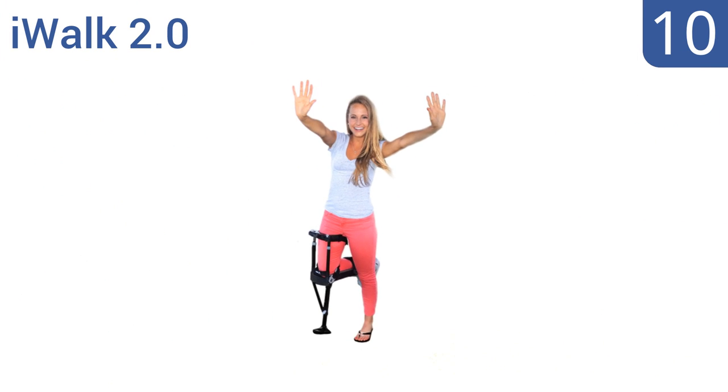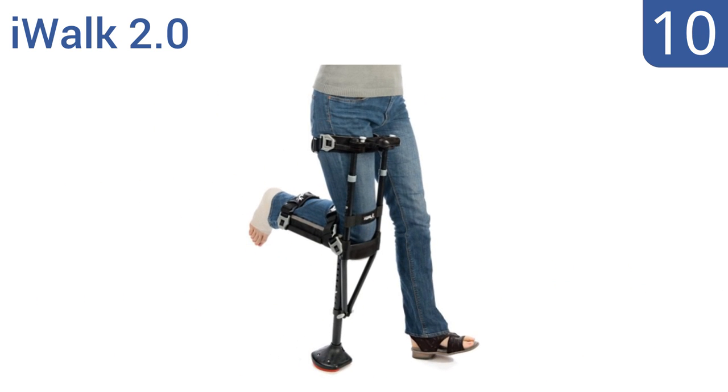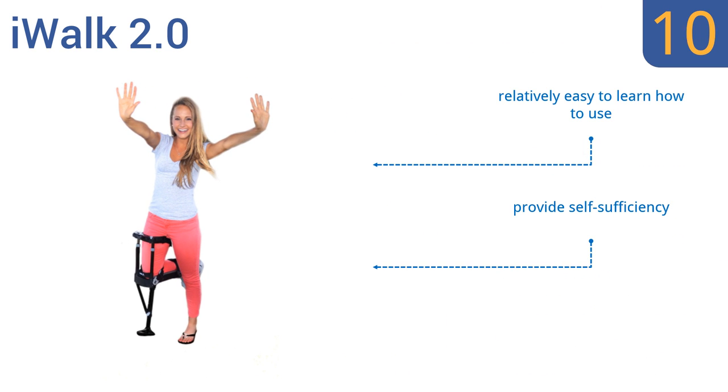Starting off our list at number 10. Different from standard style crutches, the iWalk 2.0 offers completely hands-free operation and is specially designed for assisting patients with non-weight-bearing lower leg injuries. However, they're not ideal for steep inclines. They are relatively easy to learn how to use and provide self-sufficiency, but the straps take a long time to remove.